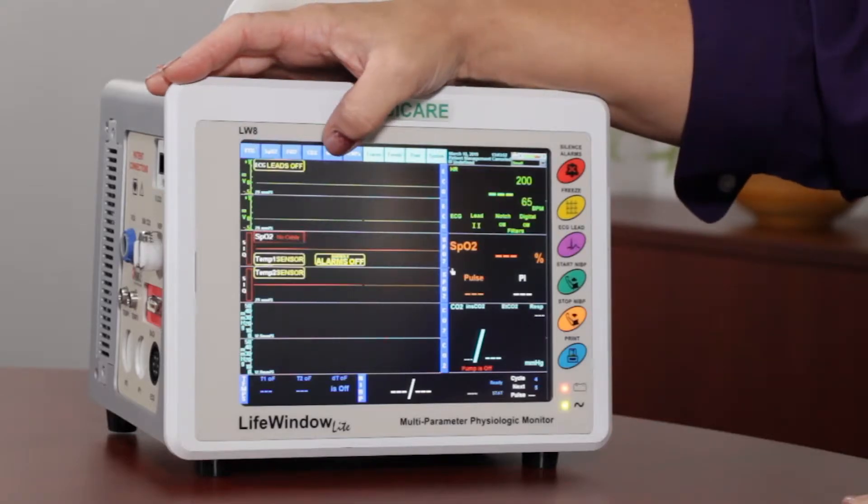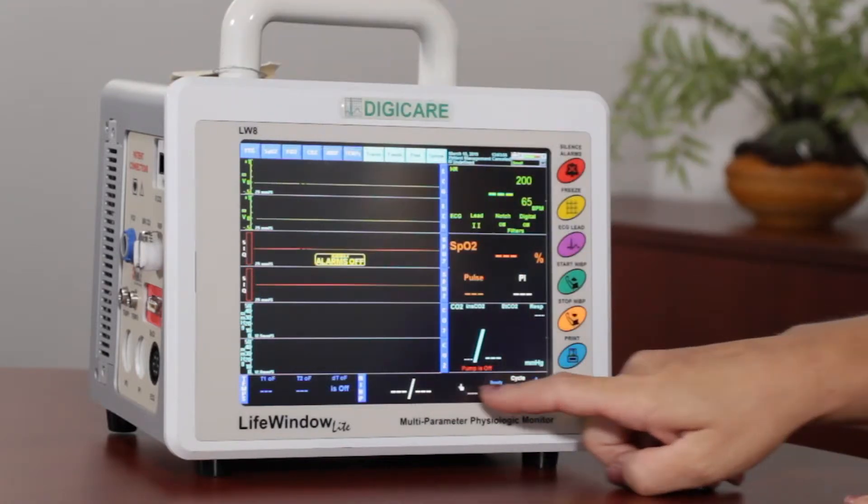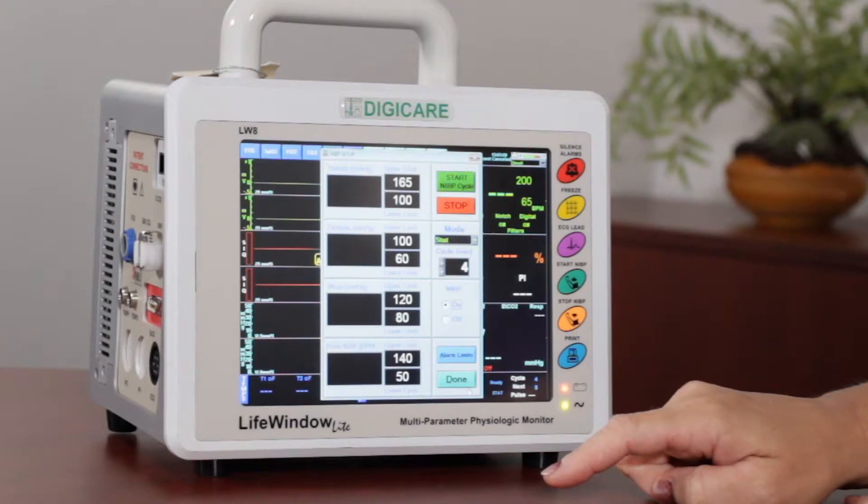To access the blood pressure settings, you can either click on the blue tab or down here at the bottom you can touch on it.